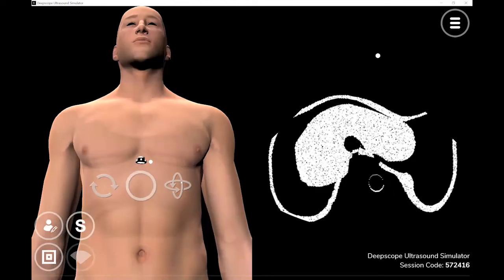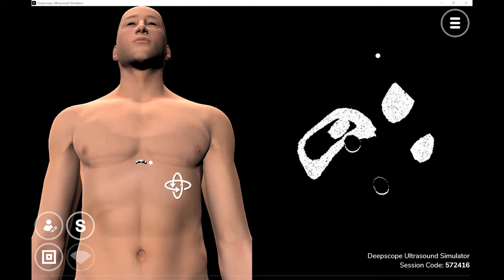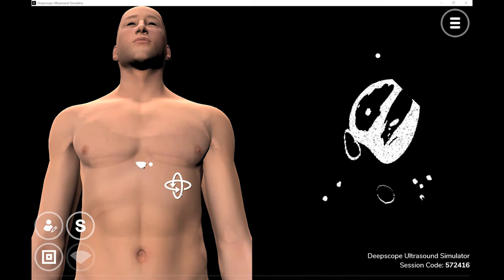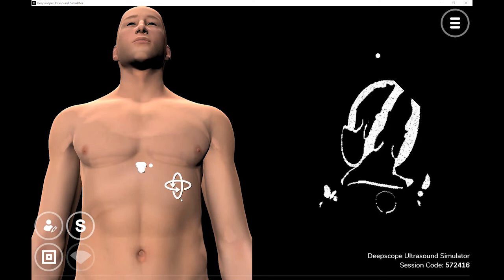Now to get a subcostal view, you want to tilt or fan, depending on which term the instructor wants to use, with the ultrasound beam pointing more to the anterior part of the body. Right now, I'm only seeing the ventricles, so I know you're going to have to tilt more. And now there's a subcostal view. Just for you to see where the beam is shining, here's the beam shining, and now let's take off the skin.